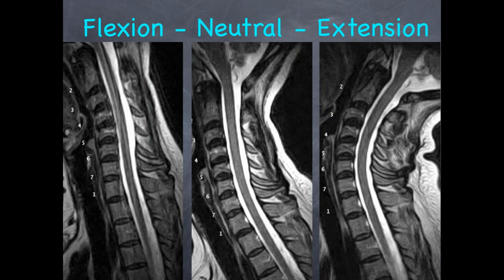In the early days, we also worked on some doing flexion extension views of the cervical spine, similar to the lumbar spine. We ended up dropping those. They really didn't add enough.